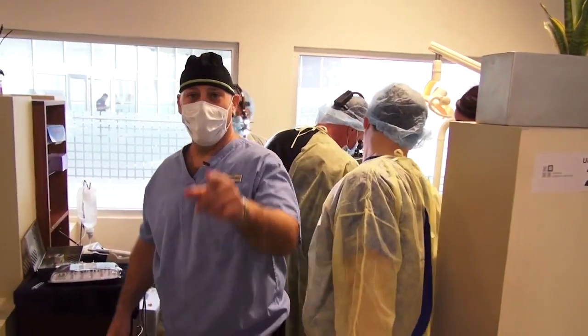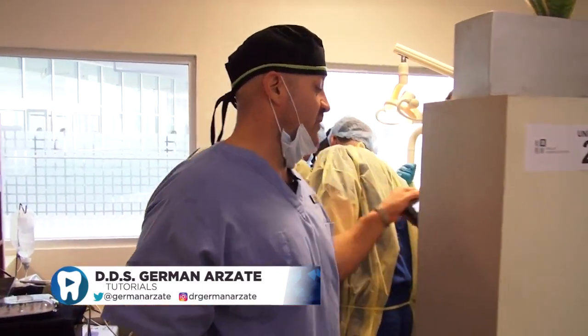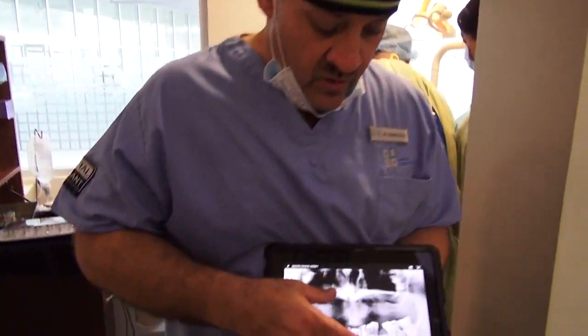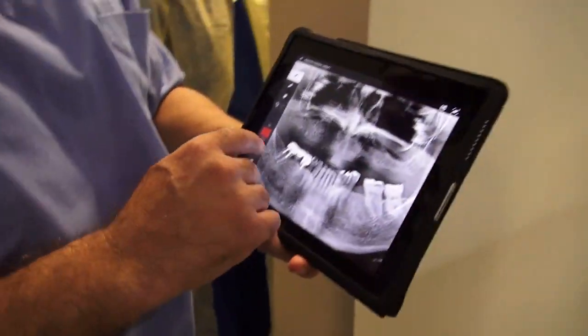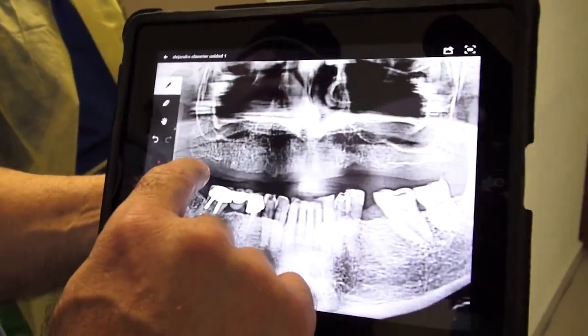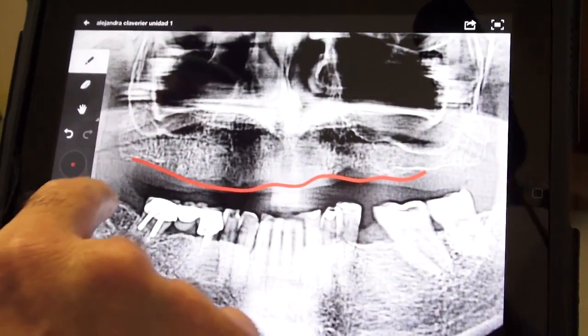Let me explain what we're doing today. We have a patient with an upper fully edentulous maxilla — this is a sinus.